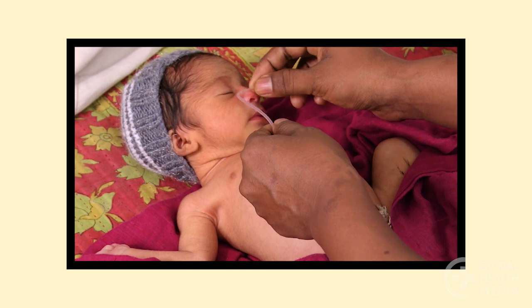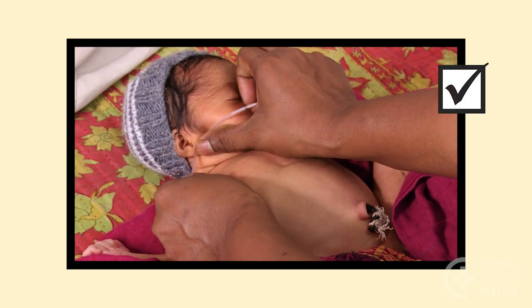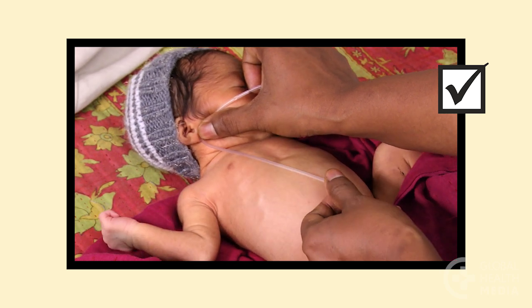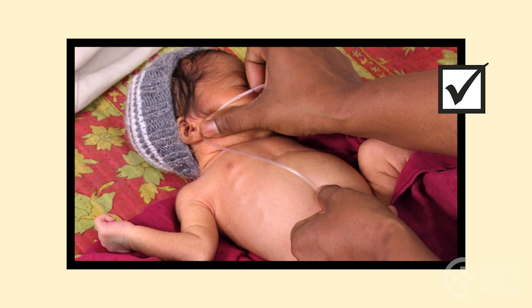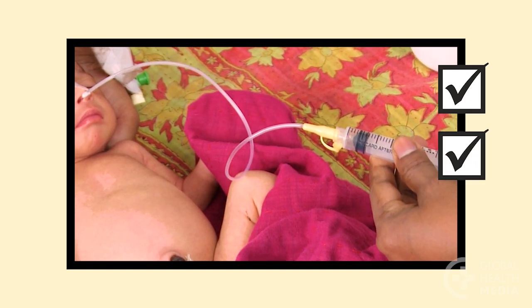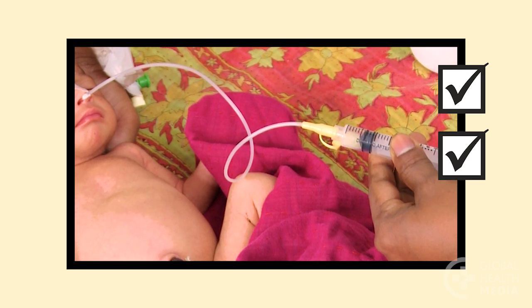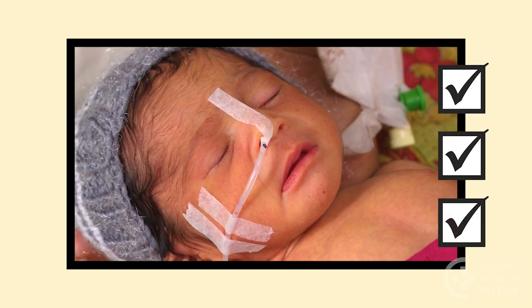Remember: measure the tube from nose to earlobe to a point halfway between the tip of the breastbone and the umbilicus. Confirm placement by pulling back on the syringe to find small amounts of digested milk or gastric fluid. Tape the tube securely near the nose or mouth.